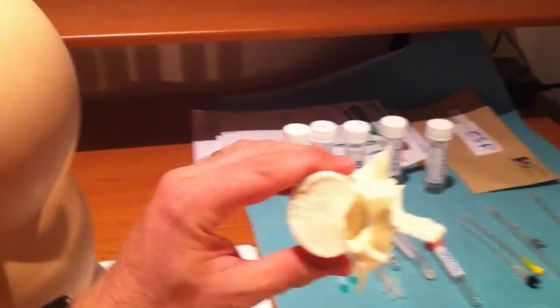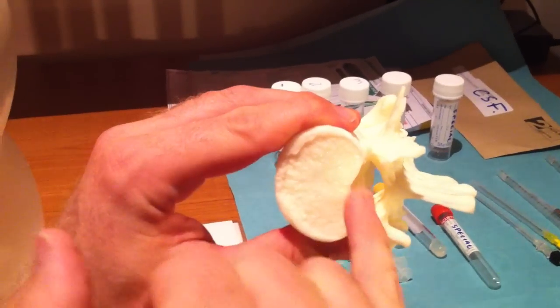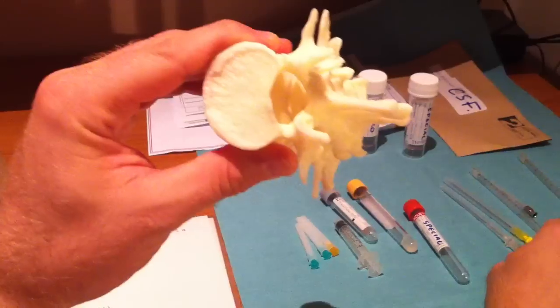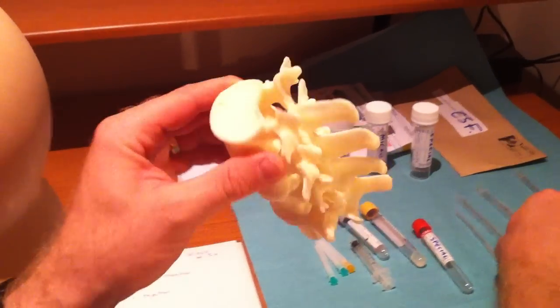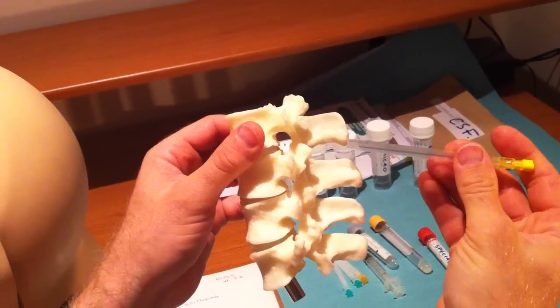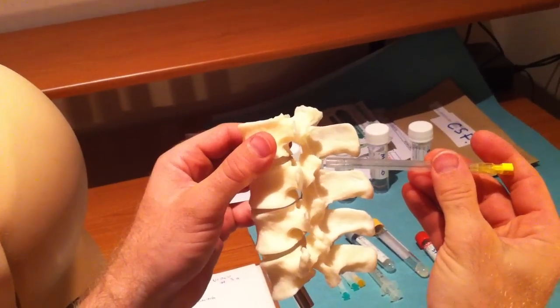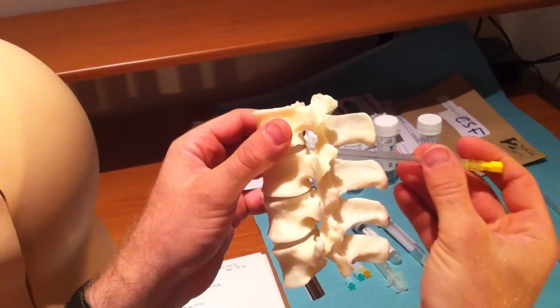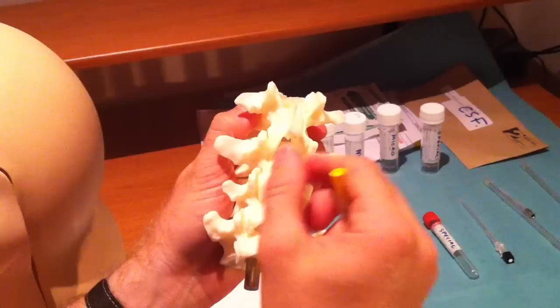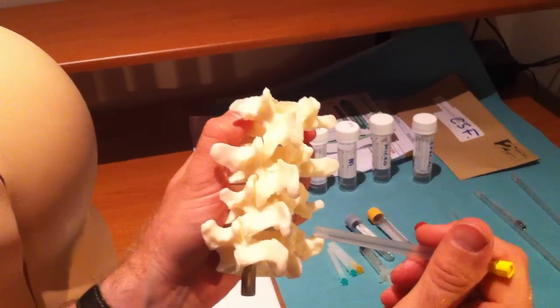The needle itself is aiming for this diamond-shaped spinal canal, and within there is where the CSF lives. When putting the needle in, we're aiming to put it between the spinous processes, in through this diamond-shaped or triangular-shaped opening between vertebral bodies.